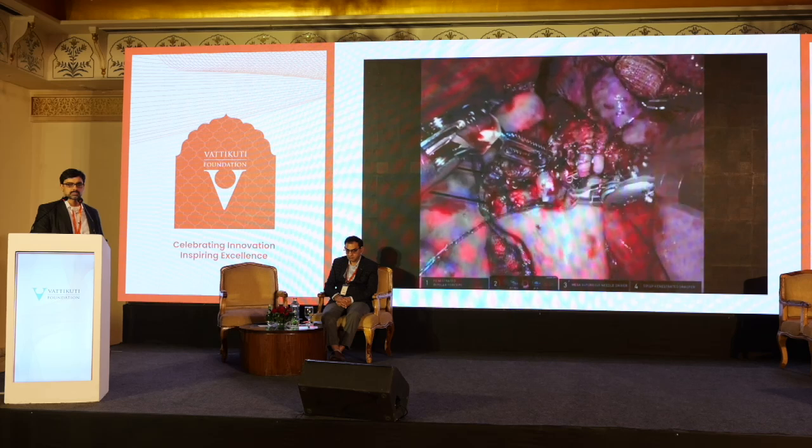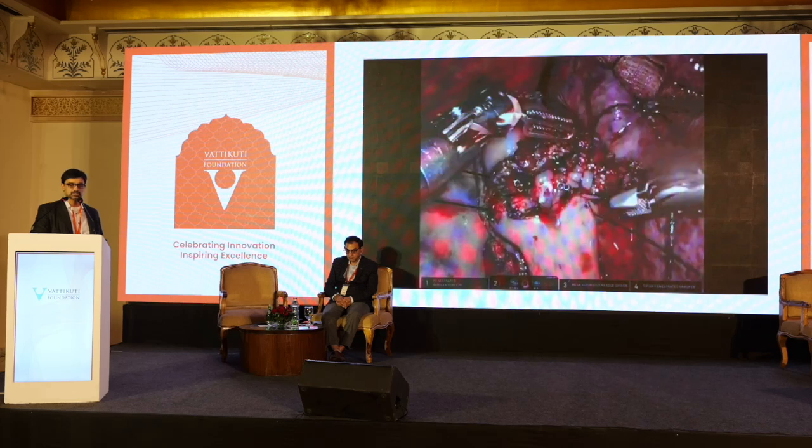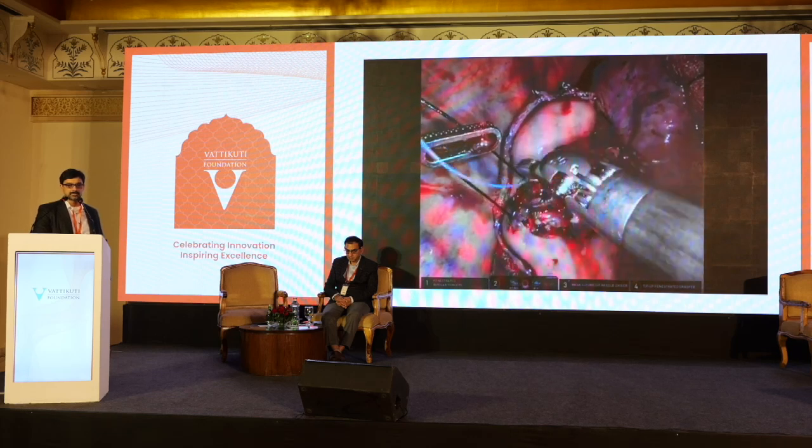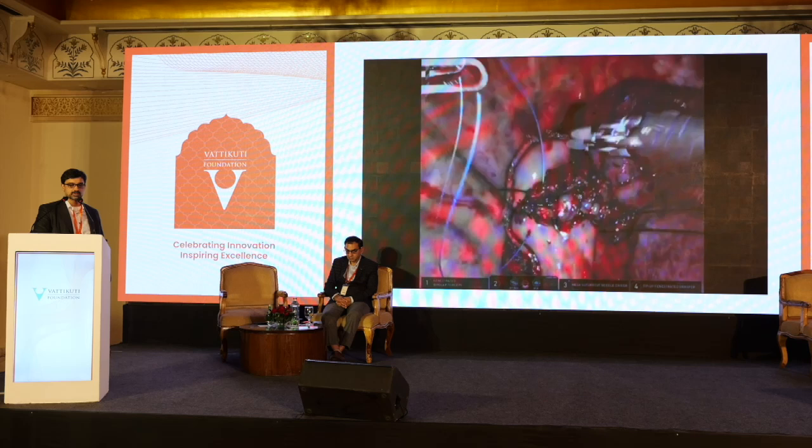So usually with these we use a 6-inch V-Lock suture, sometimes a 9-inch depending on the situation.